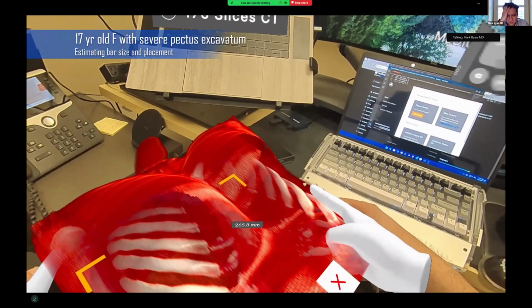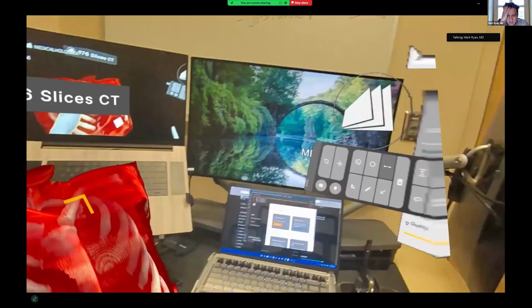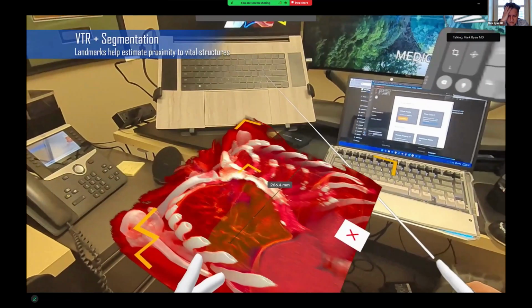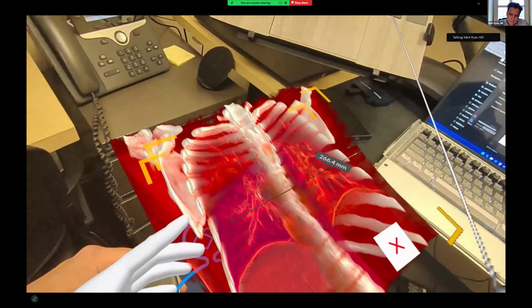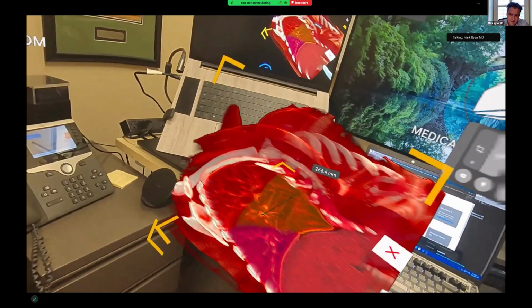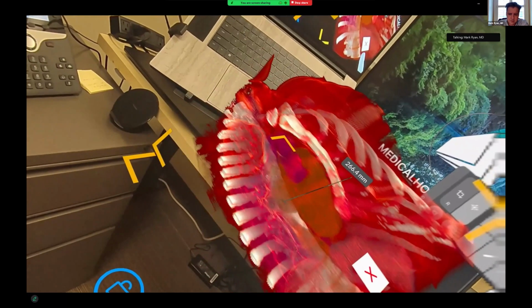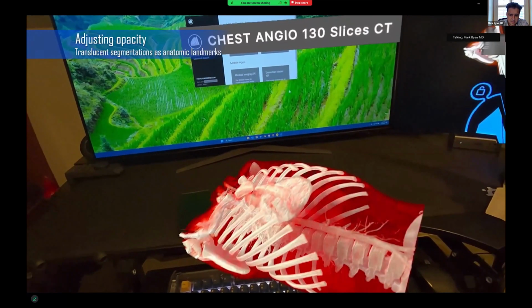It's about planning hardware placement, and it's helpful to know the relationships of things like the heart and lungs. So what I can do is use TotalSegmentator, the AI model, to bring those organs in. That's just more data, more information to look at while I'm doing these planning sessions.